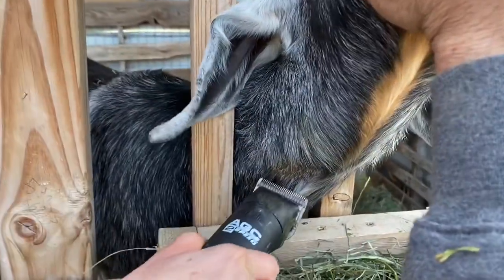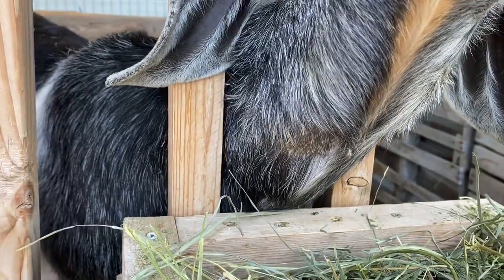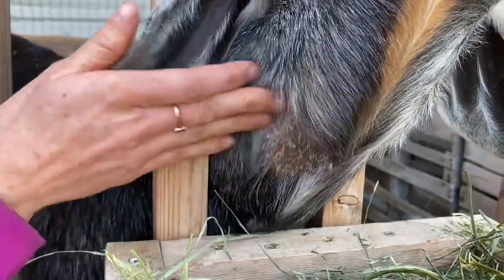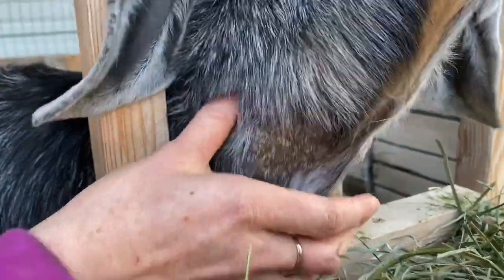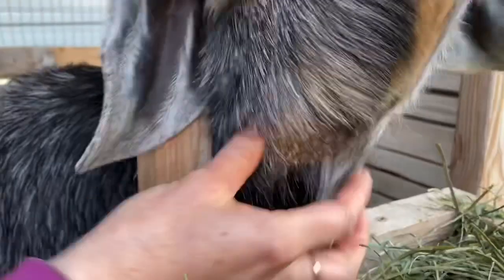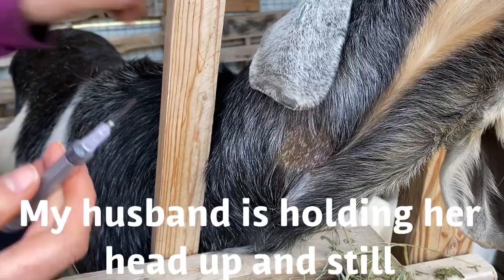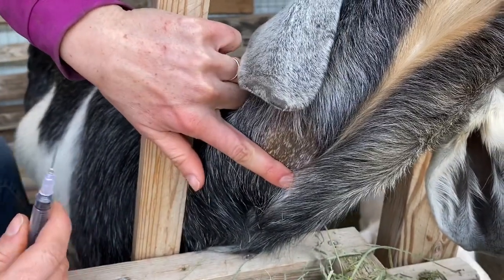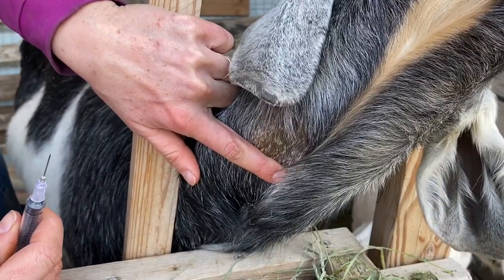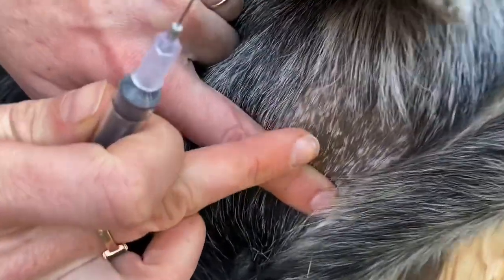I'm just shaving the little patch right here on the side of the neck. You can see the trachea goes down the middle, and then you can feel where there's hard muscle on the side — right in between those two is where the jugular vein runs. I'm using a 22 gauge needle and I'm going to hold right here with my finger so that vein will start to fill up with blood. You can feel it — it's almost bouncy.